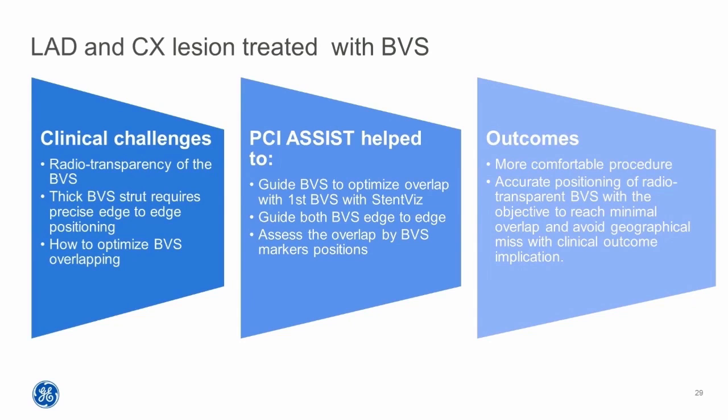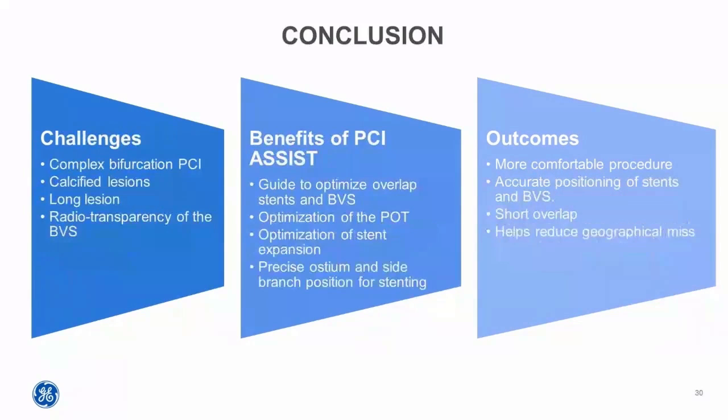So it is clear that this PCI assist is very helpful for the use of BVS, which are very radio-transparent. So in our daily practice, we need some tools to optimize the visualization of this kind of devices, to optimize the PCIs for very young patients.